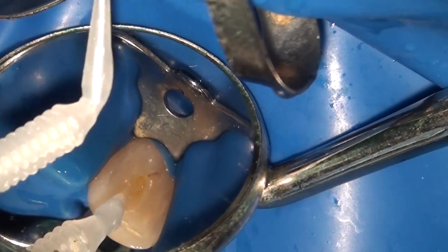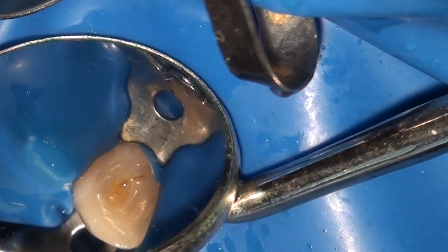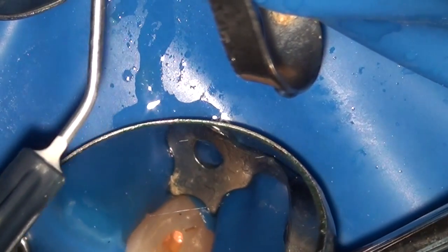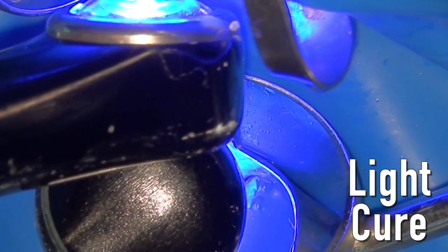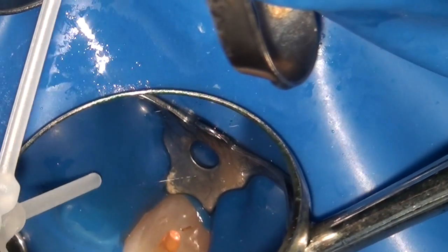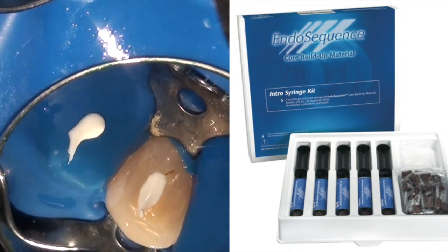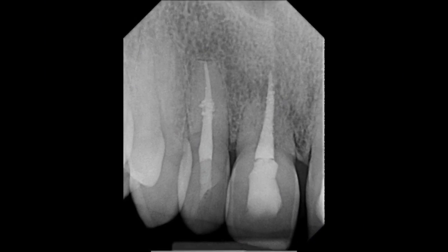Now we proceed to fill the access opening. I place the Endosequence core material — a reinforced composite requiring bonding — using a dual-cure bonding agent. Remove the excess with a gentle stream of air to thin out the bonding agent, then cure it. Once cured, place the opaceous white Endosequence core material: extrude a little of the mixed material first, then fill the entire chamber in bulk-fill fashion, and light cure the whole thing. Here is our final fill.